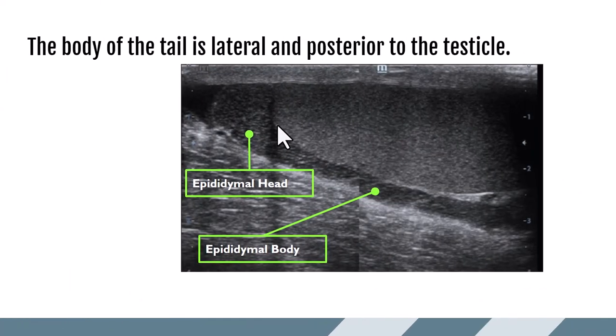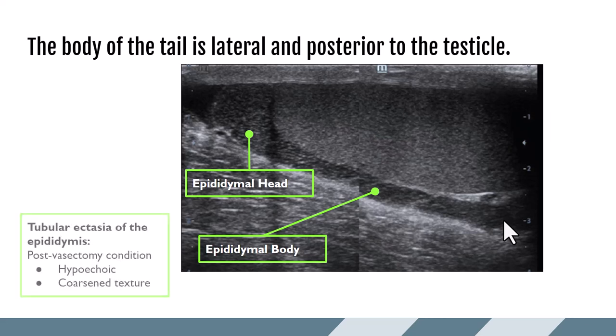Here is another example of the epididymis in relation to the testicle: the head on the superior pole, and then the epididymal body connecting through and running posterior. If you don't see it directly posterior, come out very lateral on the testicle and you'll usually see it right on the edge running just slightly posterior. In this example the epididymis is quite a bit more hypoechoic and very coarse — this is tubular ectasia of the epididymis, commonly seen after a vasectomy where the vas deferens has been severed and sperm can no longer leave, causing dilation of the tubules.